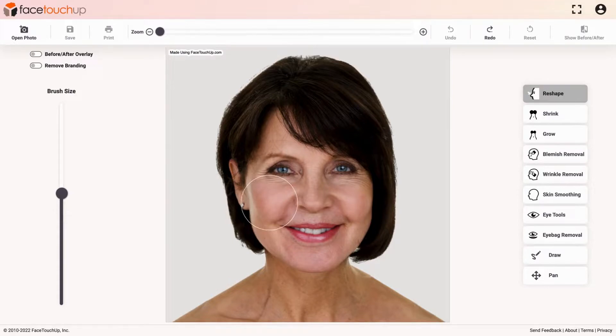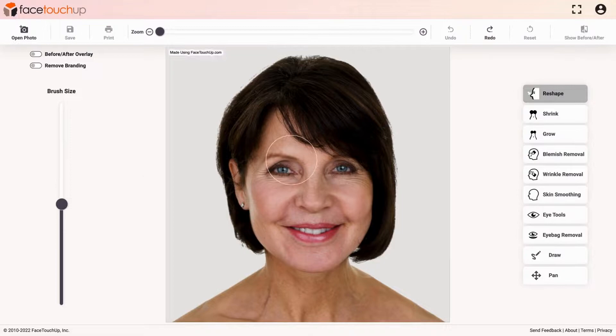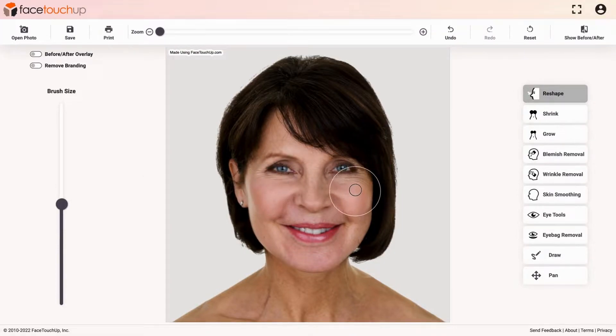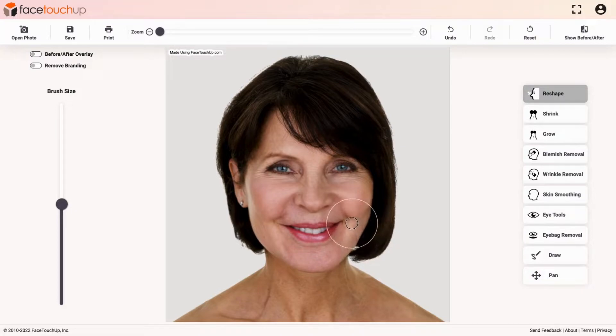In this case, we are going to uplift the cheeks. Select the brush size according to the size of the cheeks. Now, lift the cheeks with the tool by doing the same for both cheeks. Lift further from the side of the cheeks to make it even.